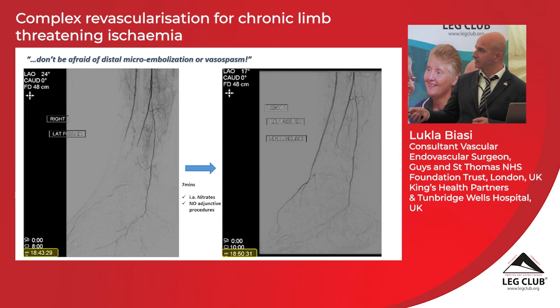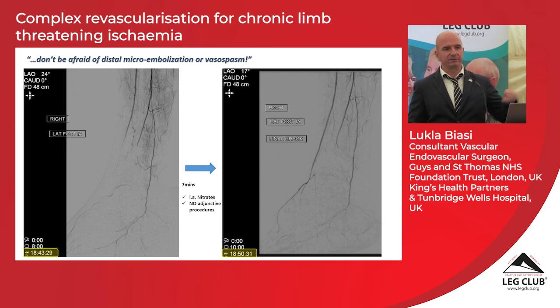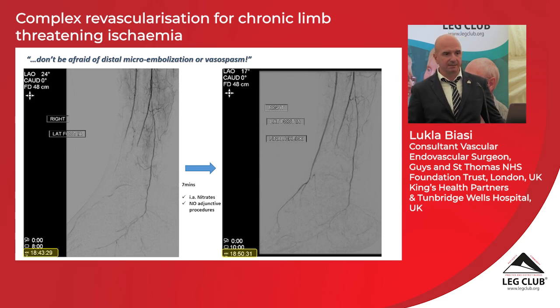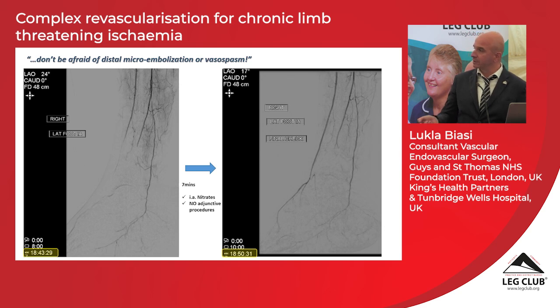The common femoral artery, the profunda, which is a branch running in the thigh, and the main superficial artery and popliteal artery are now flowing like a normal artery. Those are the tibial arteries, just to confirm that no clot has moved farther down to compromise the circulation in the foot. Of course, that is a complication. It's not always an easy or straightforward procedure, and that's why there is no indication to do preventive surgery, because even with all this fancy technology, the clot that we have tried to drill or balloon or stent higher up may end up being displaced into the arteries of the foot.